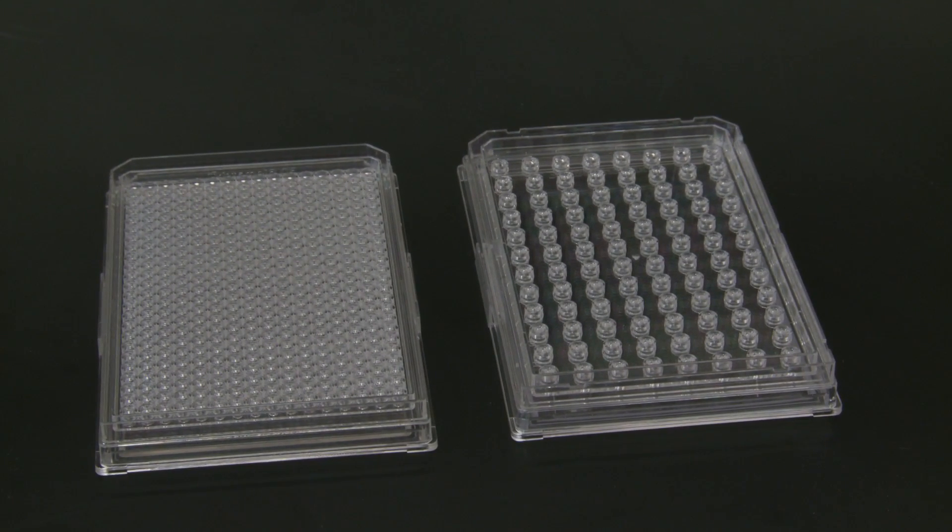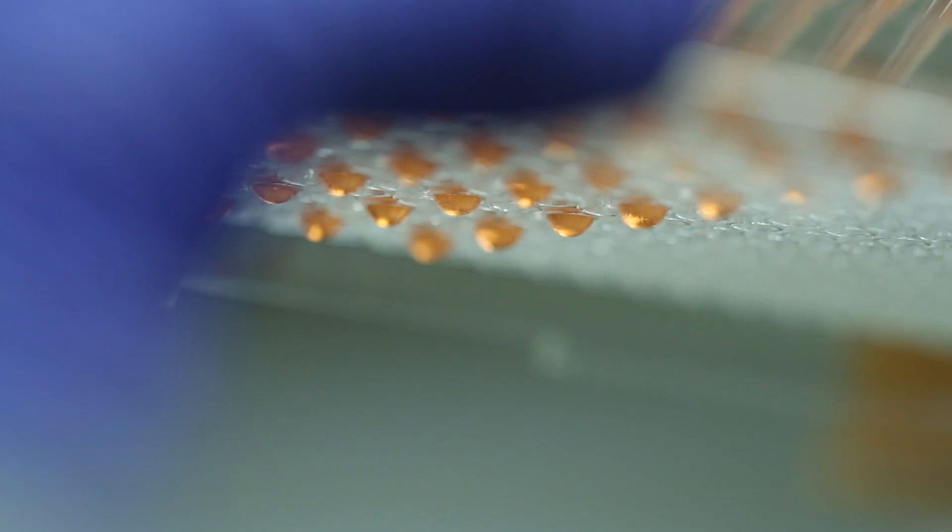The hanging drop plate allows pre-clinical researchers to mimic the human body more closely than they can with a two-dimensional well plate like a flat bottom petri dish. Our bodies are 3D — they're not 2D — yet research is still conducted in a 2D environment early on.